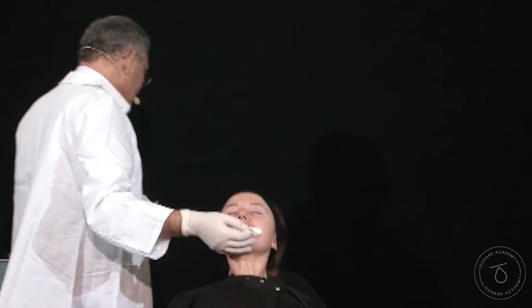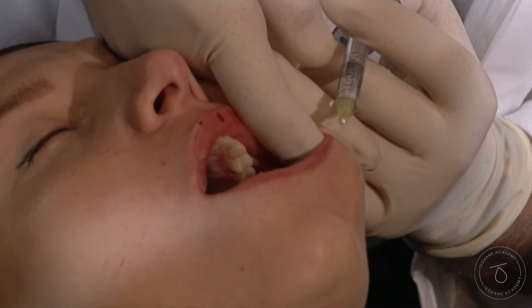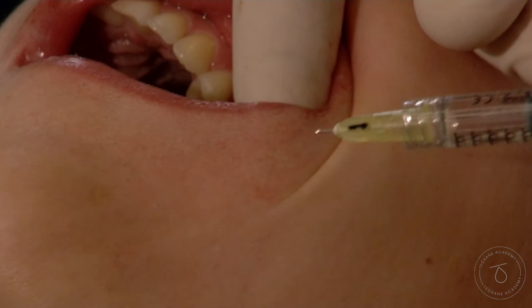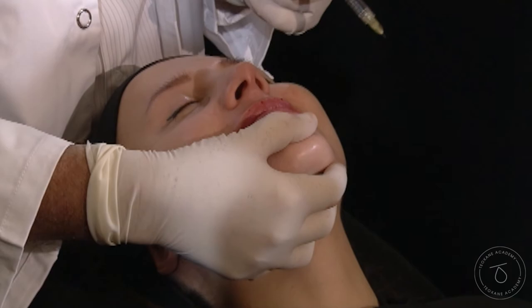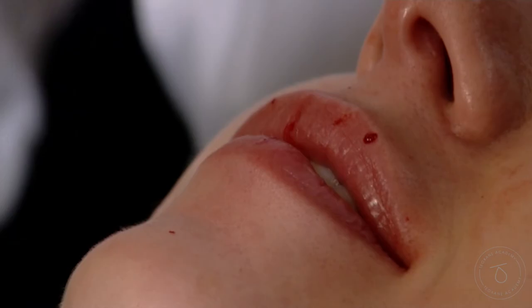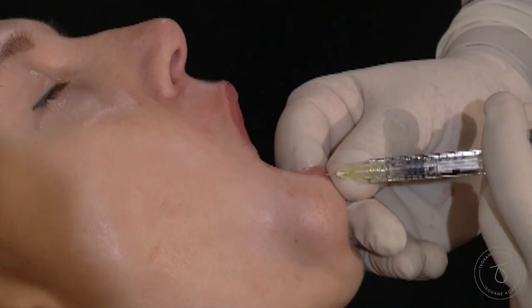Now I'm going to do the outline of the lower lip, and then I will plumb the lip. Two ways to do it: you can go all along the outline like this, put your finger in, you see the whitening of this virtual canal. I personally prefer reversing the lip — I press like this, I reverse, and I'm going to do the outline of the lower lip from the lower middle part, one prick, and it goes all along. I push the extra drop outside. That gives me the balance. I've done some drops here and it's missing on the other side. This is a very old technique for me — doing the outline this way.